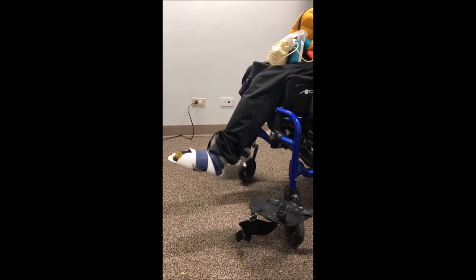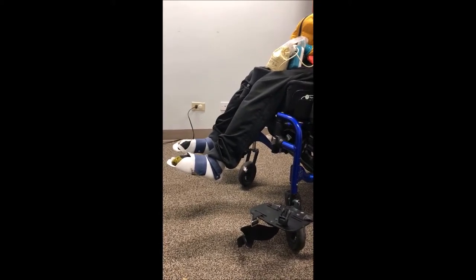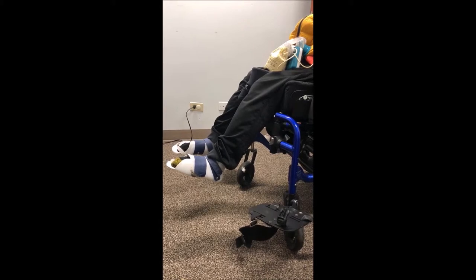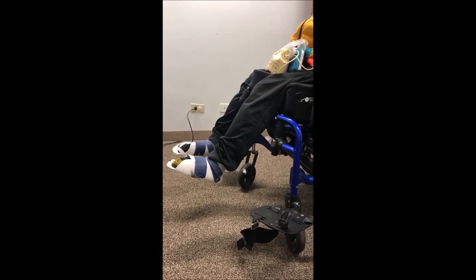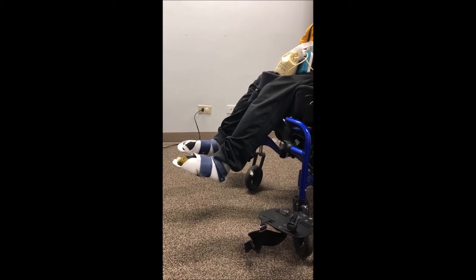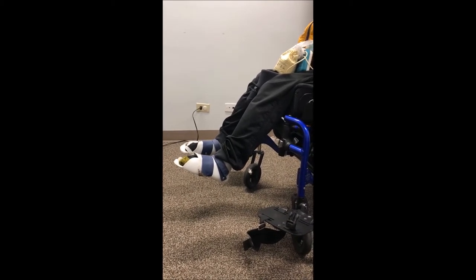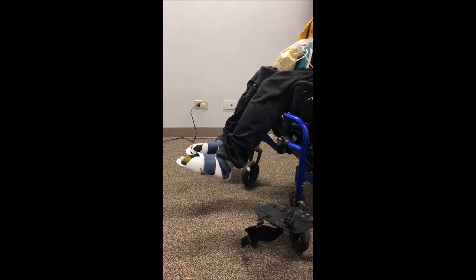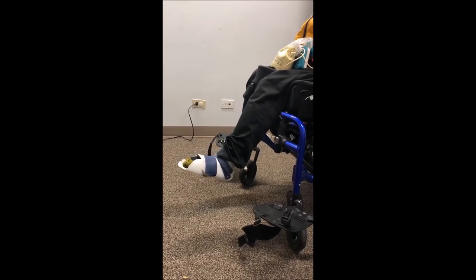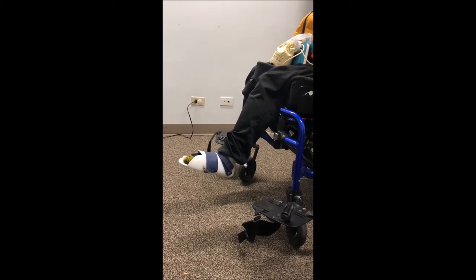Instead, I have swung away the footrests in order to see how his legs move when they're not strapped to the footplates or pressed against them. You can see there's quite a bit of extension at his knees. A dynamic footrest would move with his legs, diffusing force that otherwise would provide him leverage against the footplate surface and encouraging those feet to then come back.